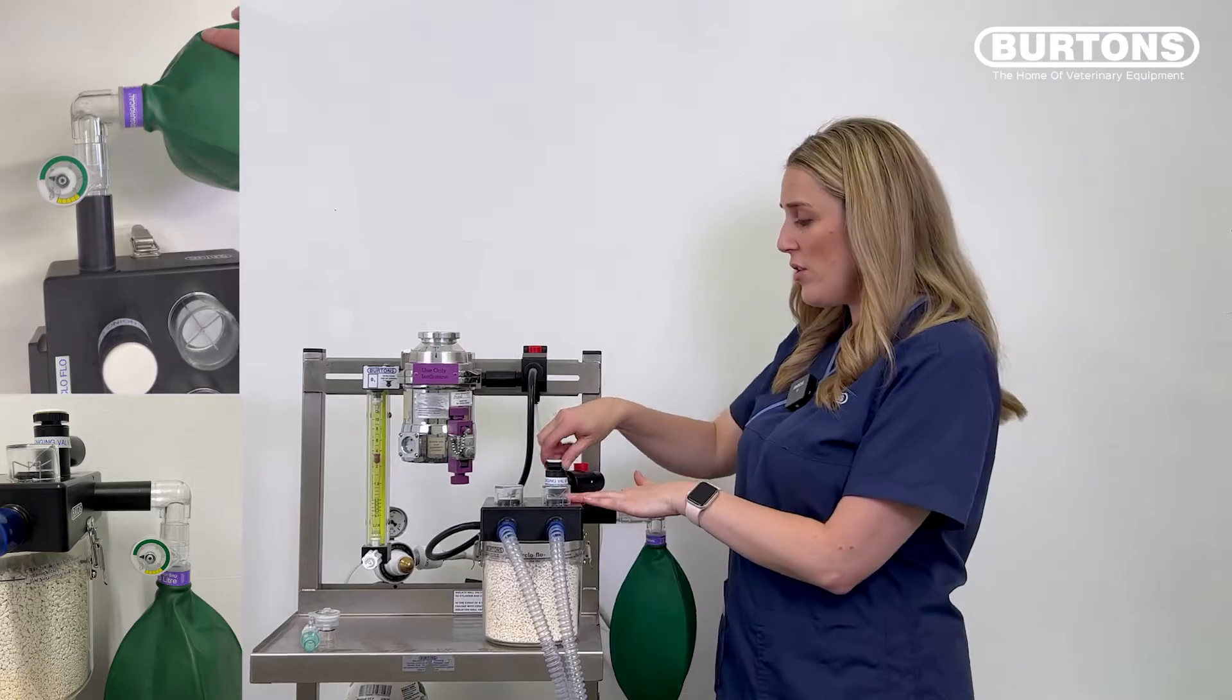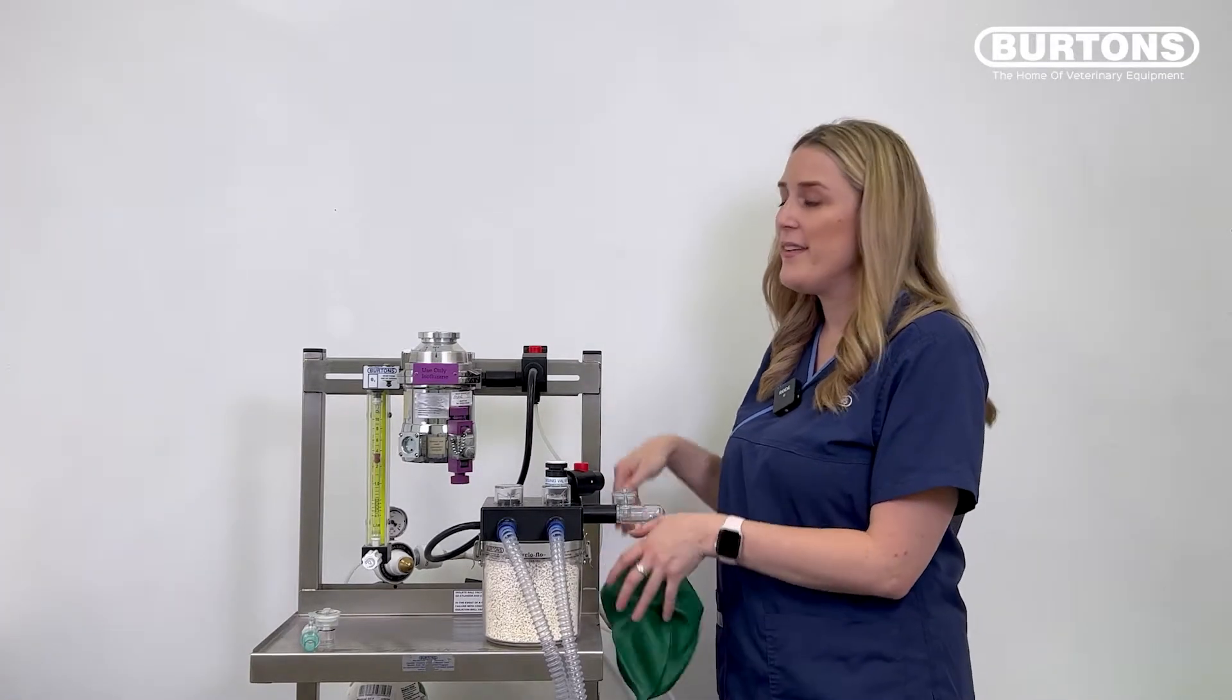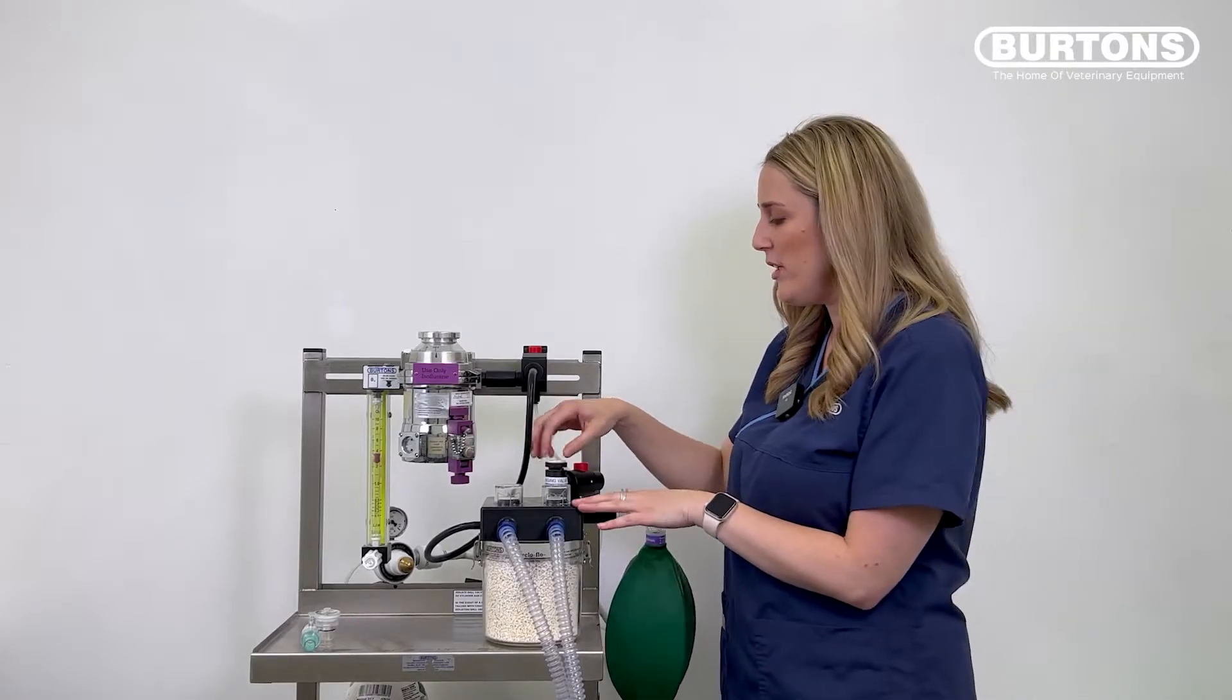This does reduce the need to have to close the valve, give that breath and then open the valve or forget to open the valve.